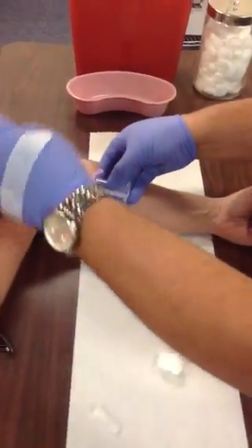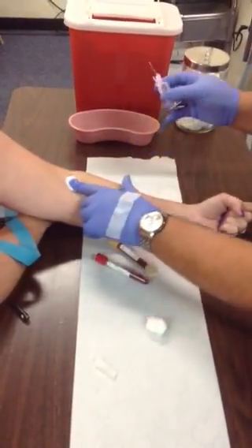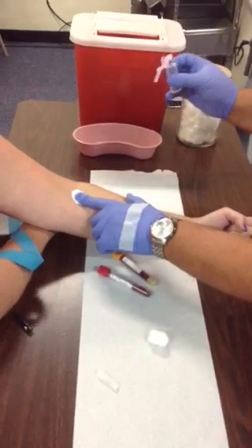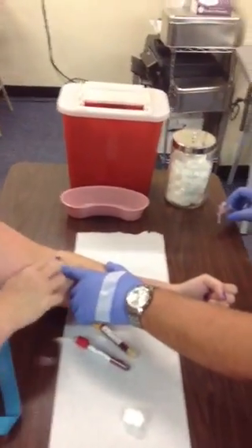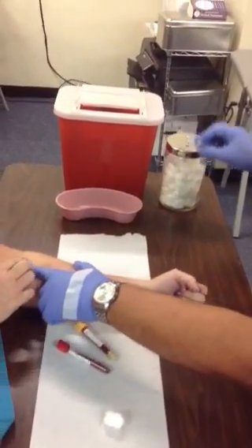Pull the tourniquet, grab your cotton ball, and pull the needle out. With one hand, use the table to activate the safety device, and throw that away.